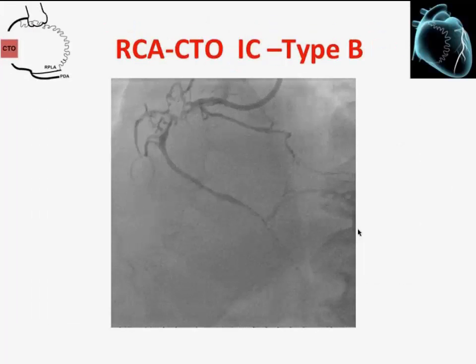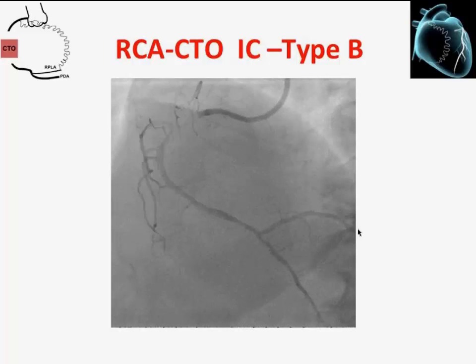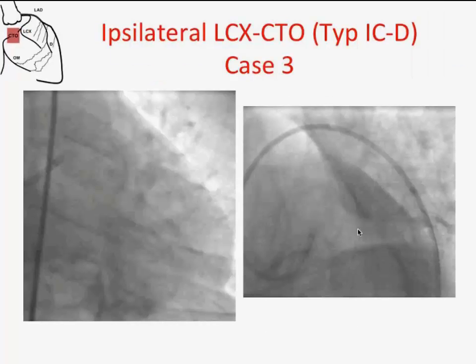One more question regarding the single guide. I see most of your cases with a single guide. Many people here in the U.S. like to do the ping pong, the two guides. Any thoughts? Do you think one guide is enough, or two is easier, the same, or what are your thoughts on that?